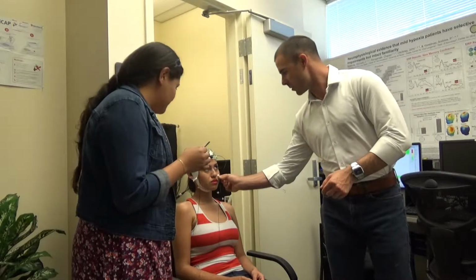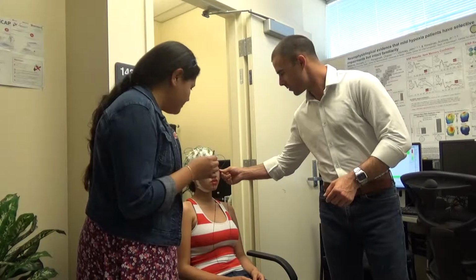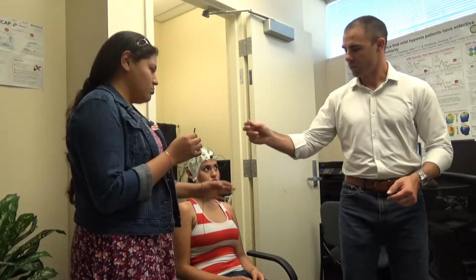This is going to be placed right here. We're going to place another one there. Then we're going to have a horizontal one. Okay? So, can you hold that for me for just 1 second?